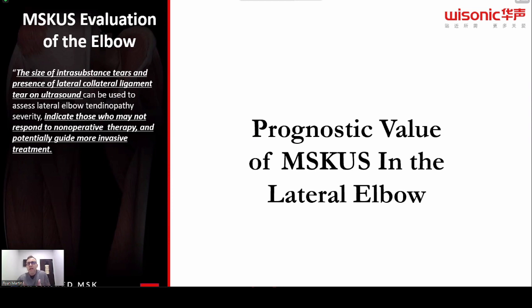Again, less invasive than surgery. You can utilize these views and acoustic windows and this criteria on tendinopathy versus tears as your criteria on, hey, we can keep this person in-house for the things that we do, or if you're a surgeon using ultrasound, hey, this is a good example of, hey, this probably needs to go under. So it has great prognostic value and diagnostic value.